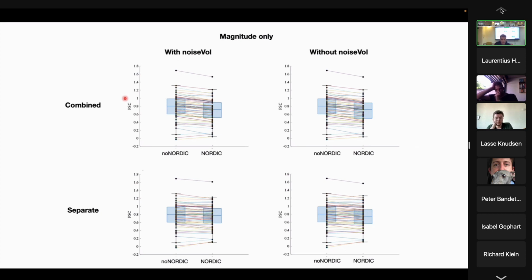So we get an overall much more complex signal that needs to be described. And when we do have more signal components, it can become more difficult for the PCA to distinguish signal and noise components.